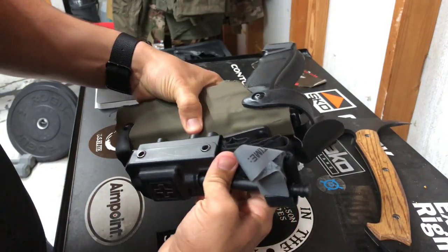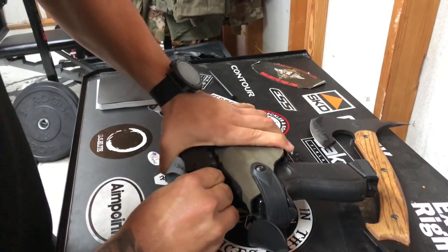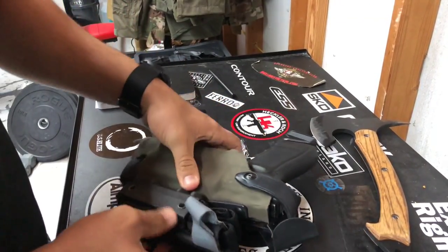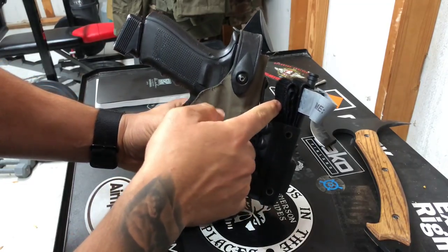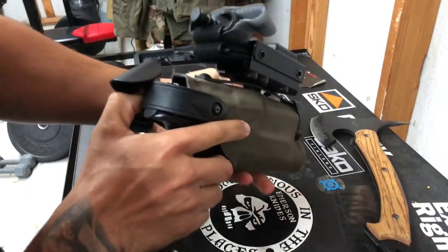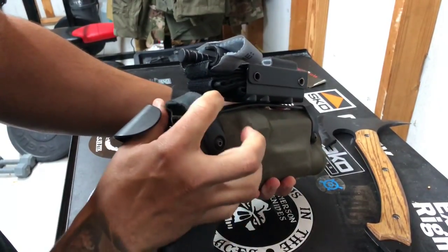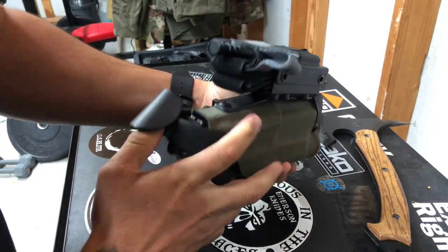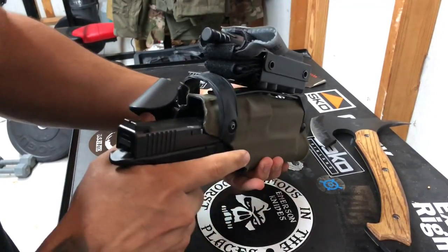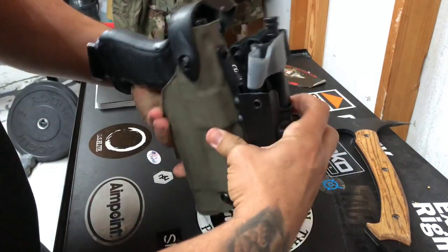Now I'm going to put it in my pouch. Depending on the pouch, it's going to depend on how many times you have to fold it. For example, on this pouch, I want the back piece a little further in so it doesn't mess up my draw — I don't want it getting stuck to where I can't get my gun out. So I make sure it sits nice and low so I can still draw if I need to.